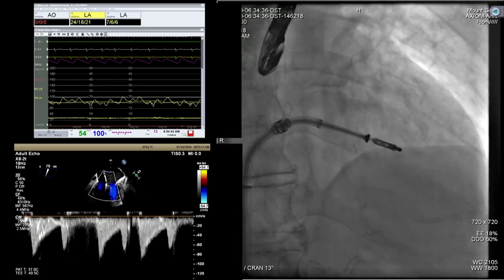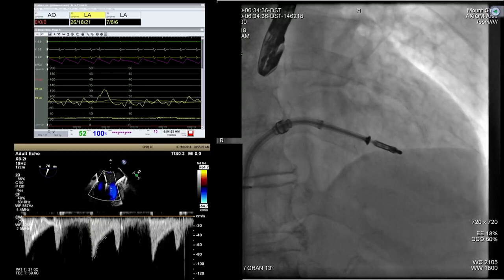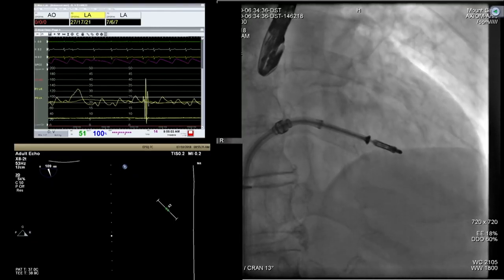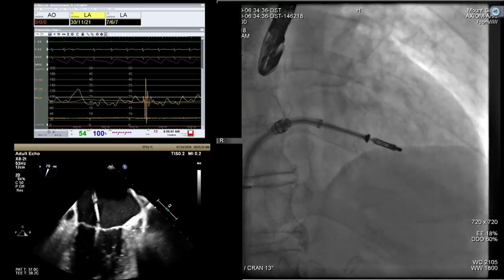One thing maybe, Gilbert, you can comment. You measured the length of the leaflet at the beginning of the case. What is the measure you ensured to confirm that you have a good grasp of the leaflet? I think with XTR, you have 9 millimeter of potential grasping. And I think your leaflet measure is 16, right? So wow, gradient is only one. Beautiful. So Gila can certainly measure that for us on the LVOT view. We can do that next. But that's a beautiful result.